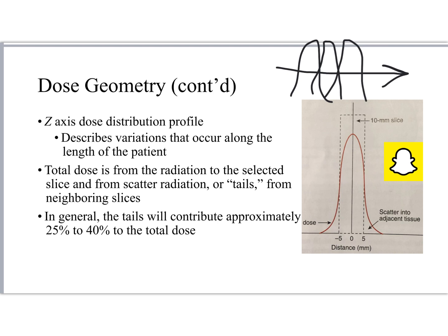So this z-axis dose distribution is kind of irregular, and so we wind up with tails that contribute approximately 25% to 40% of the total dose. It's just tailing. It's completely useless to us. Ideally, as she indicates in the book, we would love to see a dose profile along the z-axis that just follows this nice, neat volume square here, where each slice just receives some uniform amount. We do not like this out here. This is the problem, right? That kind of ghost thing there.